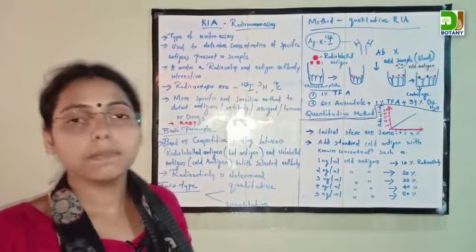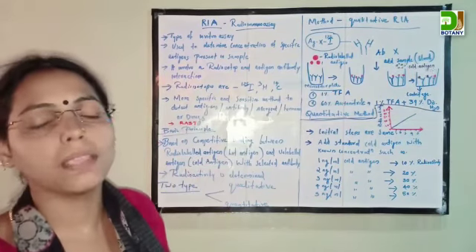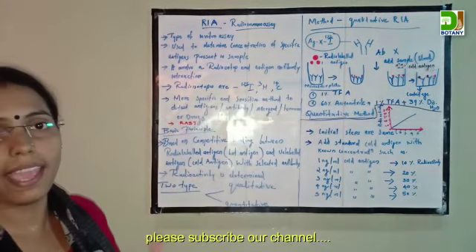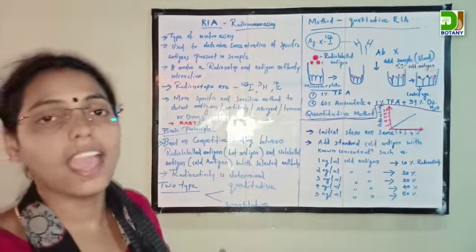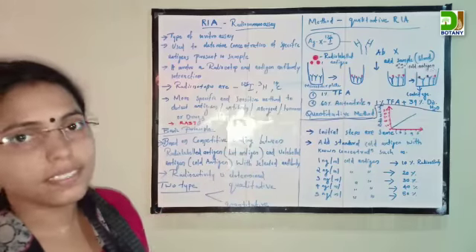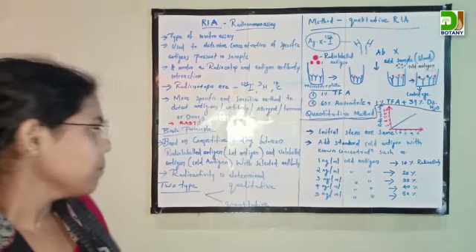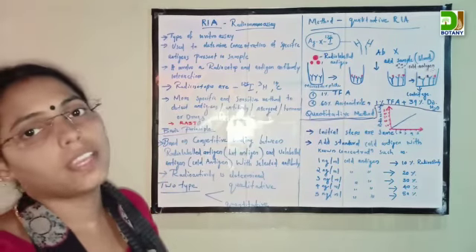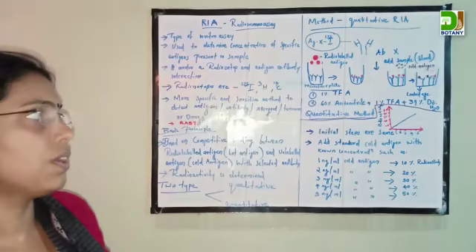The basic principle of radioimmunoassay is that it's mainly based on the competitive binding between radiolabeled antigens and unlabeled antigens with selected antibodies. Finally, we collect the supernatant and measure the radioactivity of the samples. Then there are two types of radioimmunoassay: qualitative and quantitative.